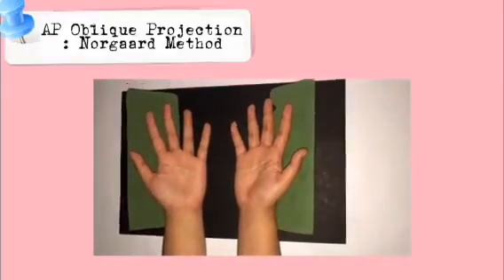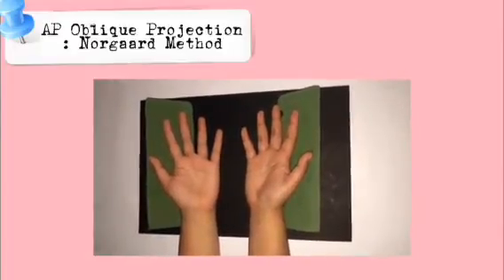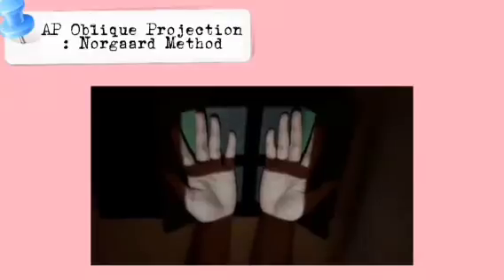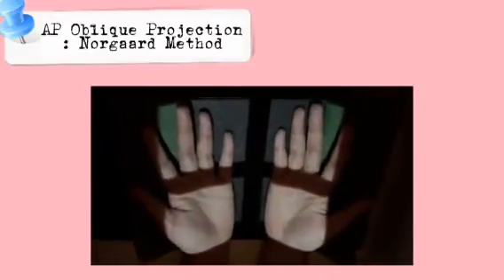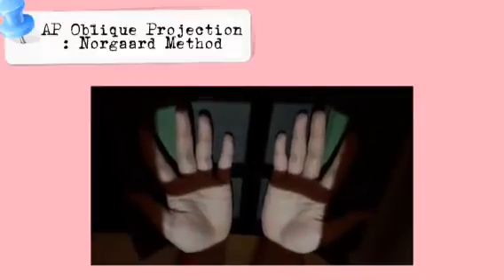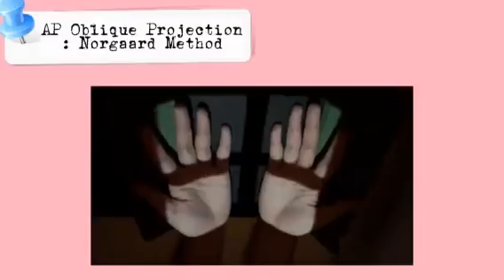Position of part. Have the patient place the palms of both hands together. Center the MCP joints at the medial aspect of both hands to the IR. Both hands should be in the lateral position. Place 2 45-degree radiolucent sponges against the posterior aspect of each hand.